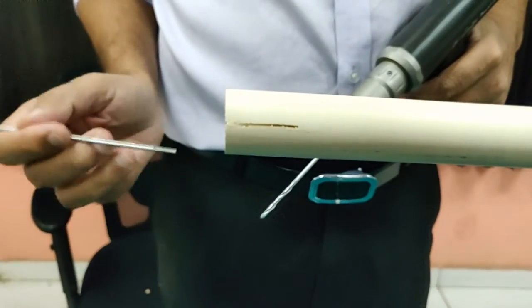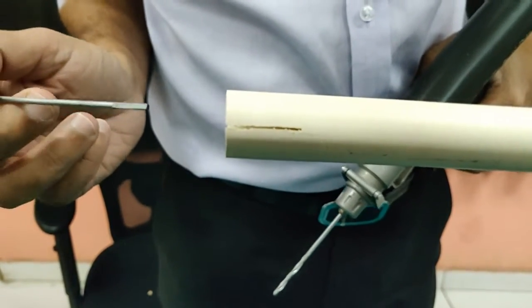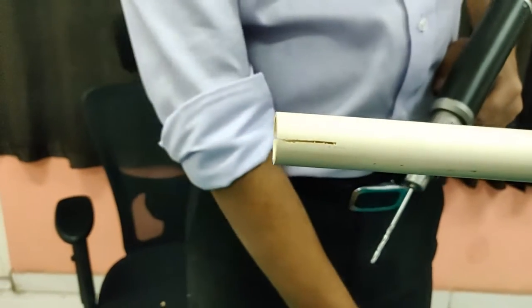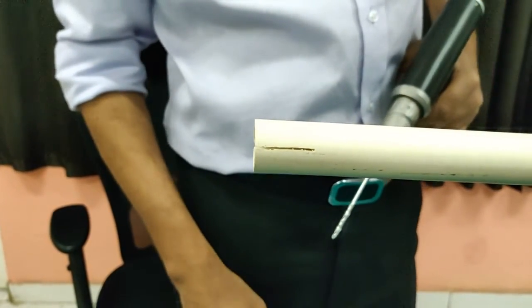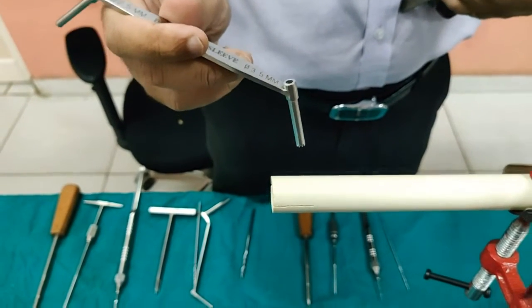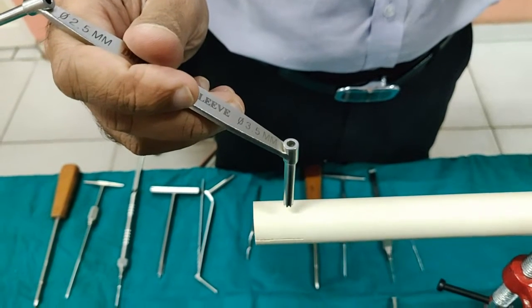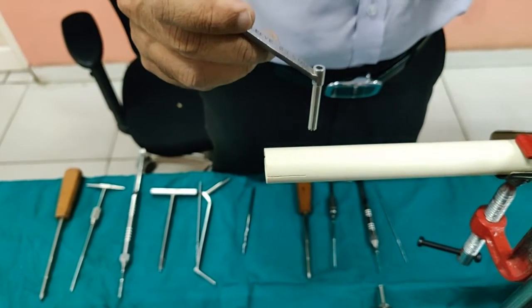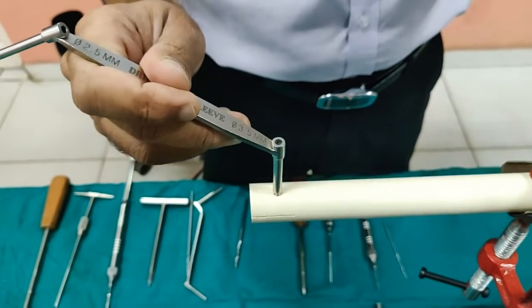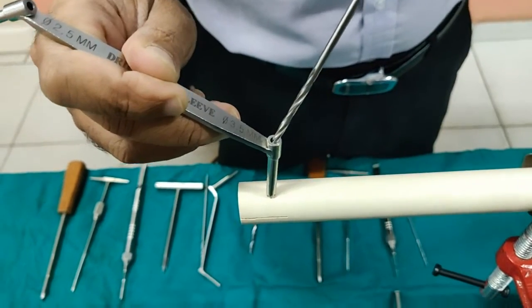The main purpose of a lag screw is to create compression to achieve primary bone healing. For demonstration purposes, I have created a fracture on a plastic pipe and we will follow each step of applying a lag screw. I will show you small fragment first and then large fragment. The first step is to put the gliding hole, which goes through the first fracture fragment. Some people use the pilot hole first, but putting the gliding hole first has advantages — I will show you what they are. For small fragment we will use a 3.5mm drill bit.